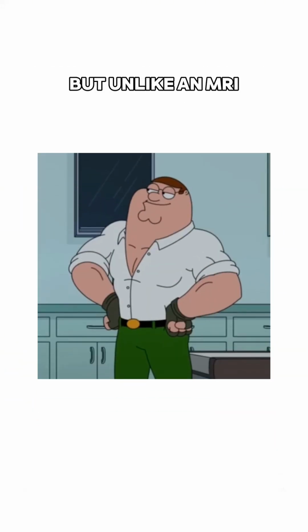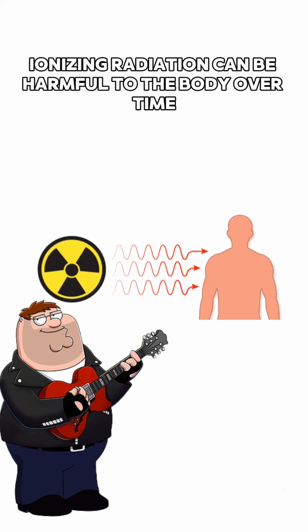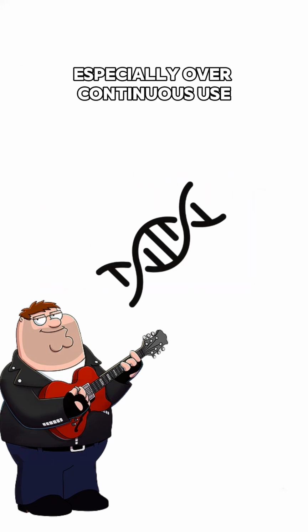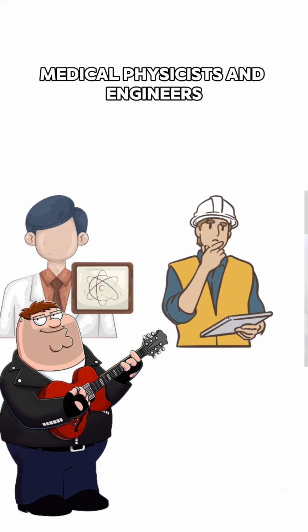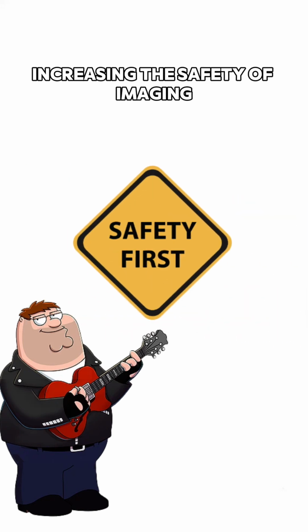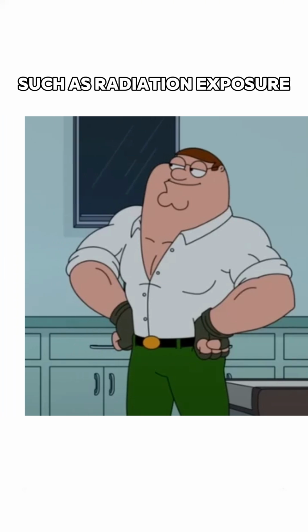You would already know this, Stewie, but unlike an MRI, CT scans expose the patient to ionizing radiation due to the high-energy X-rays. Ionizing radiation can be harmful to the body over time because it removes electrons from the atoms in the body's tissue, which can cause cell or DNA damage, especially over continuous use. Mutations to the cells greatly increase the risk of radiation-induced illnesses, the main one being cancer. In an attempt to reduce these risks, medical physicists and engineers continue to refine and develop CT scan technology to minimize radiation exposure, increasing the safety of imaging. To conclude, this demonstrates how science is responsible for adapting and evolving in response to ethical and societal concerns such as radiation exposure.